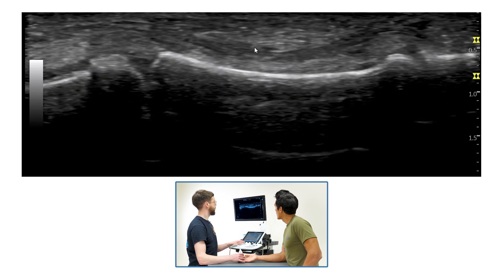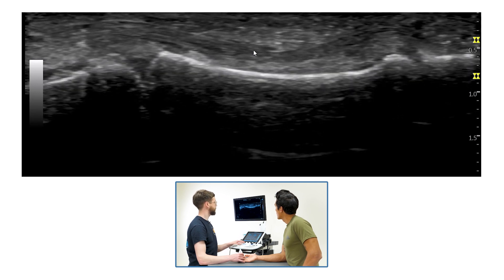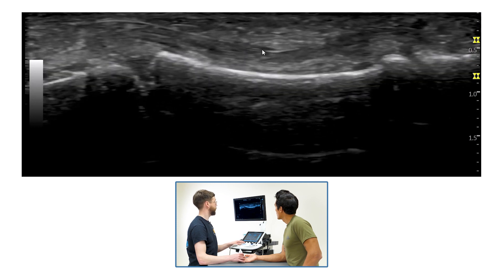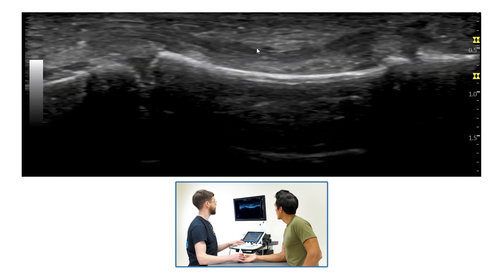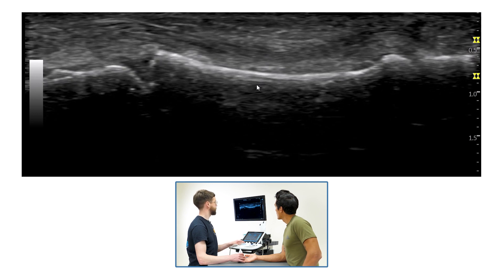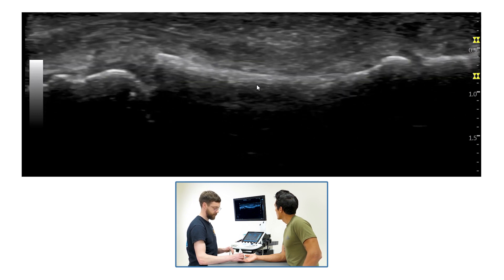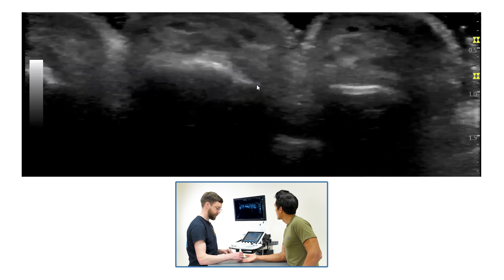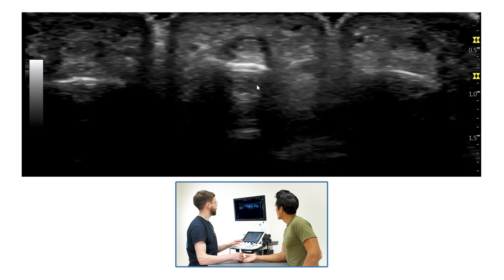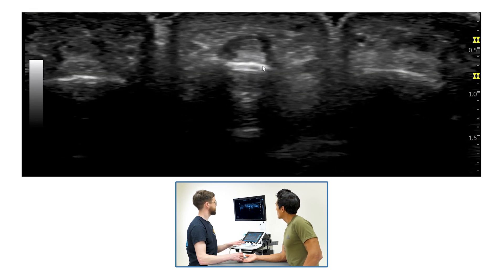With most people it is difficult to observe the A4 pulley in the longitudinal plane, similar to the A2, however it is very simple to see in the transverse plane. Let's turn the transducer around — and this is what I mean by it looking like a mini version of the A2.